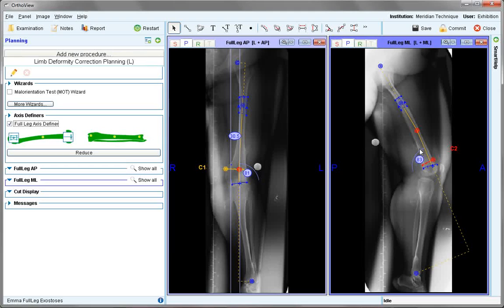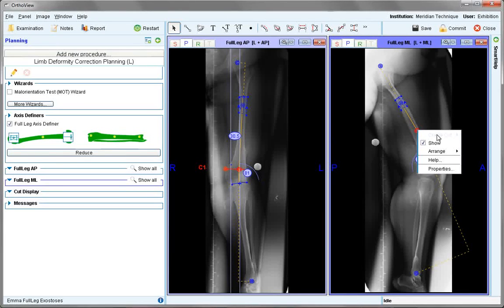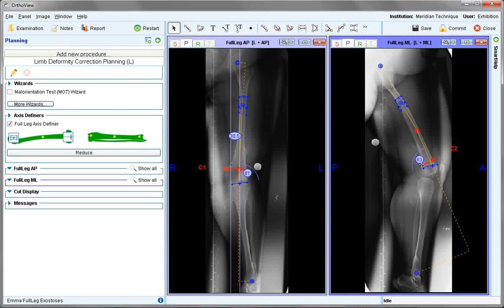If a CORA cut is required, a right click on the CORA is made, the cut selected, unlocked, and moved to an appropriate place. It is also possible to make manual cuts.